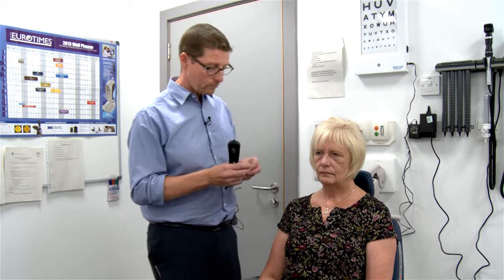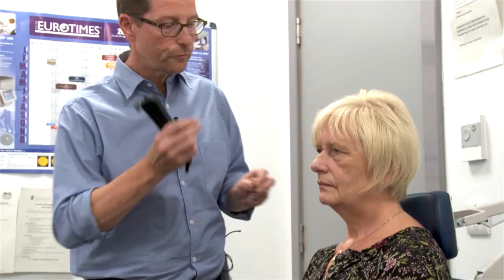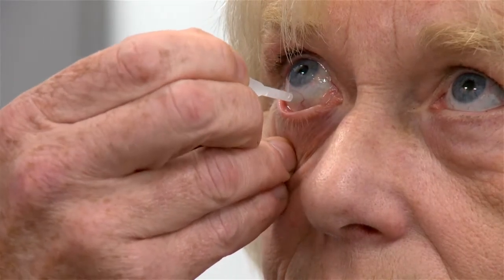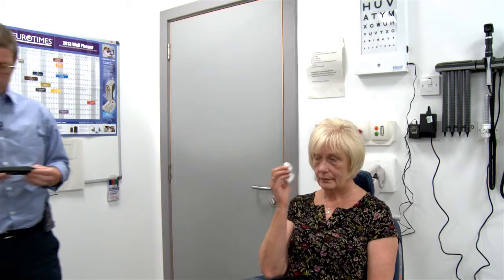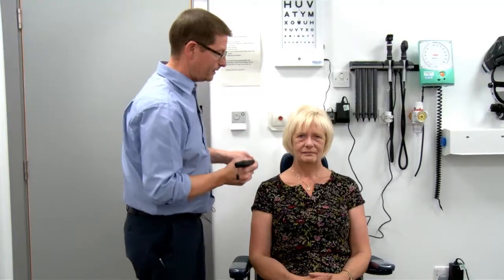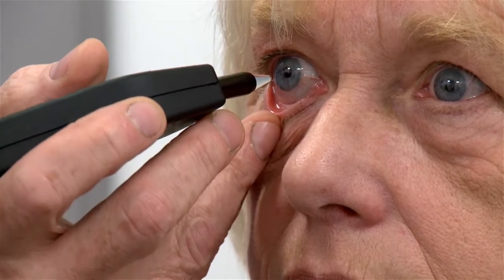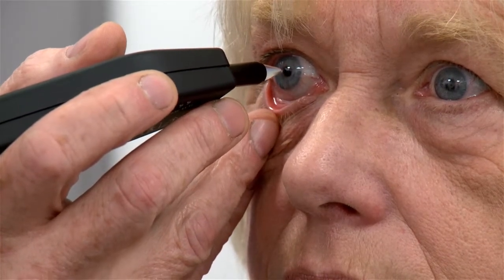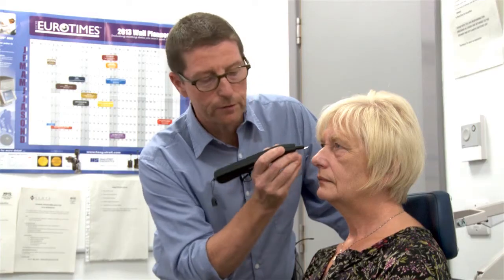To measure corneal thickness, the first thing we'll do is put a bit of anaesthetic in the eye. If you look up to the ceiling, let me dribble that in. Now look straight ahead — I'll pull the bottom lid out of the way, centre myself up, making sure I'm nicely in the middle. Nice tight beeps and there are your values.